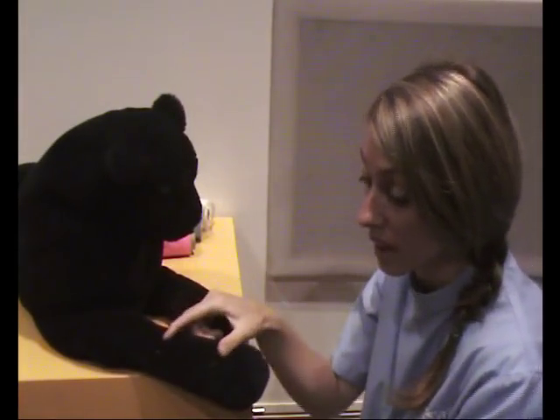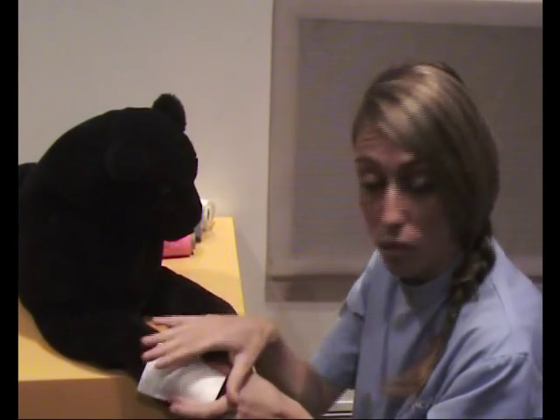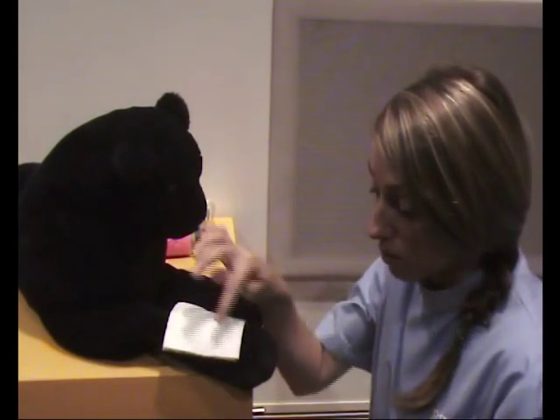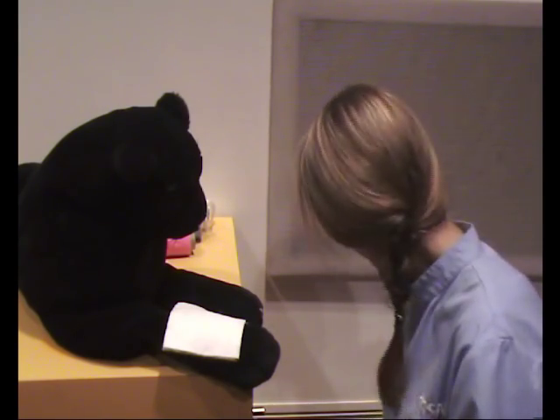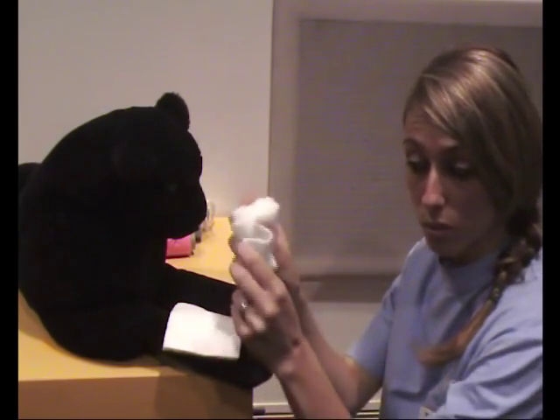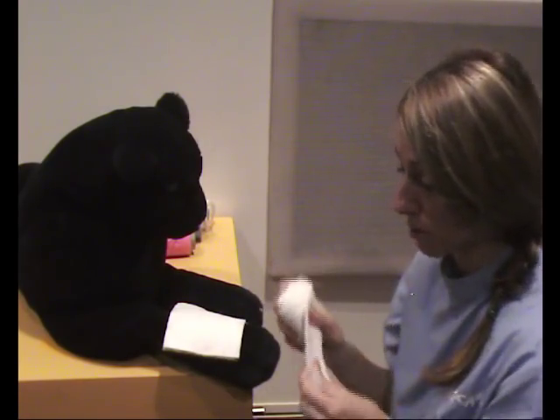In this case we'll use Melolin, shiny side down, as we said when you put it on the wound. Let's pretend Mr. Puma here has a wound — shiny side down over the wound, and preferably if it was a small wound you'd want this to cover the whole wound, about three centimeters on each side if possible. The Melolin will absorb some blood, but if you have cotton wool as an absorptive material you can use that too for extra absorption. It doesn't apply much pressure as it rips quite easily, so it's just for extra absorption.